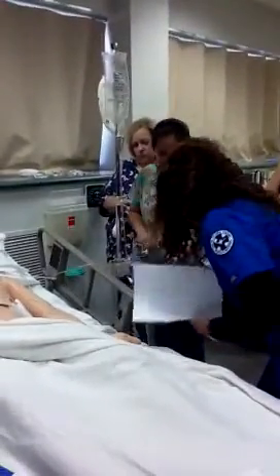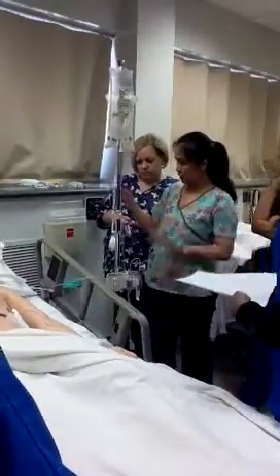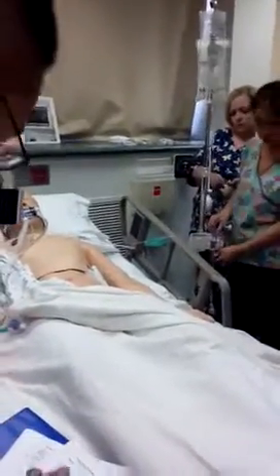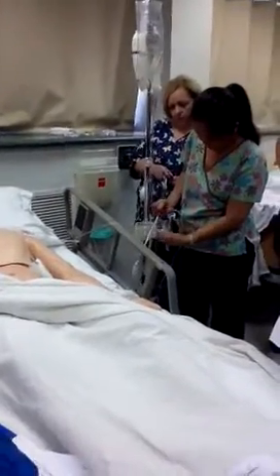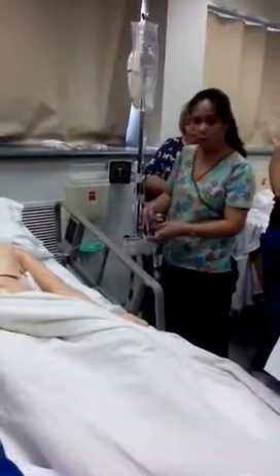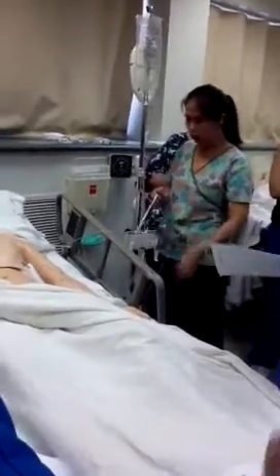I would be careful as far as down and up. Some nurses might want to do it this way. Sometimes I find it that way, and you think you're turning it up or down or not, so you really need to locate it.